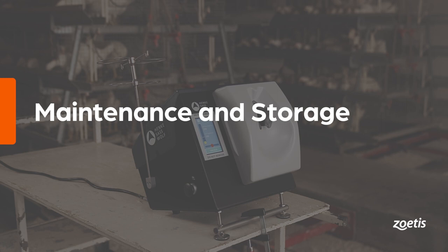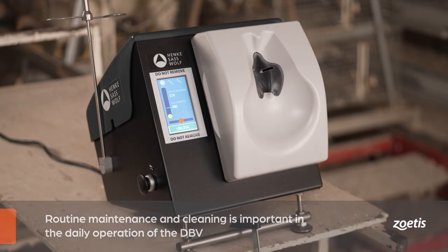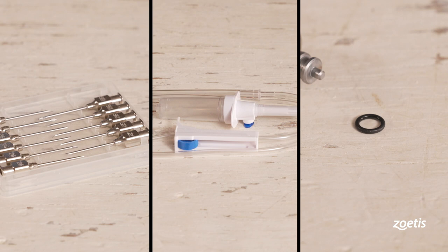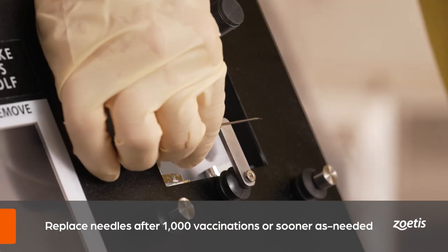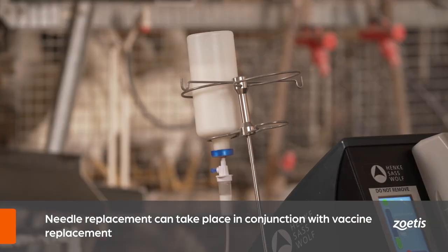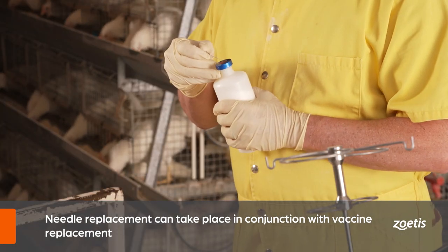Part three: maintenance and storage. Routine maintenance and cleaning is important in the daily operation of the double breast vaccinator. Once vaccination is complete for the day, follow the recommended cleaning and storage procedures outlined in the instructions provided by Zoetis. Consumables such as needles, drip tubes, and O-rings have limited lifespans — adhere to the manufacturer-recommended replacement schedule provided in the instruction manual. Replace needles after 1,000 vaccinations or sooner, depending on needle condition.